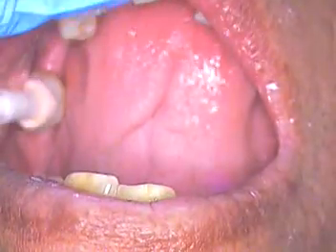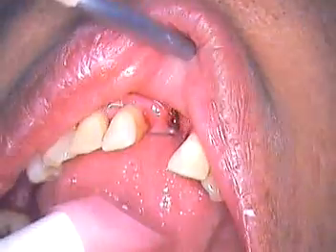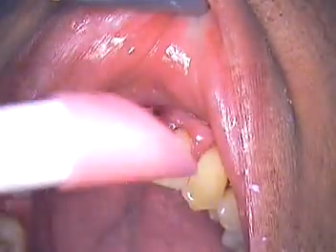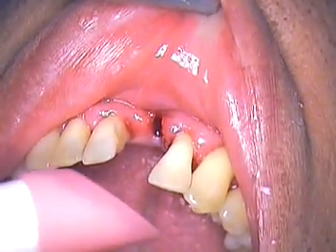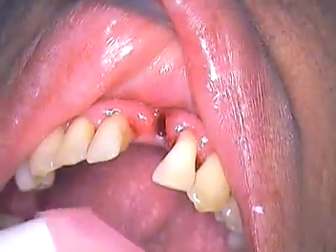So here we are, back in the mouth. We're going to score the back of the teeth. We probably need to suction that socket again. I've got a little gel foam here — I may put some in there to see if it stays quietly. If not, we won't need any gel foam. Not much bone holding that tooth in, so there's not much room to even put any type of filler. Let's see if we can just make this smaller with scissors.